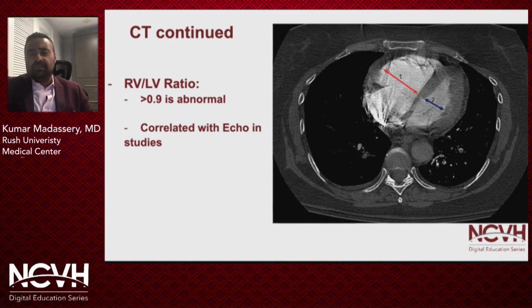As you can see on this picture, the right ventricle is larger than the left. And you can see the septum, which is in the middle, is straightened. That's not how it normally is, as usually it bows into the right ventricle. So these are some of the additional features of CT angiogram that have helped us understand how significant the clot burden is to the patient's hemodynamic status.